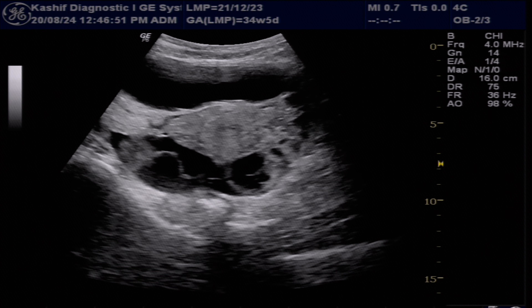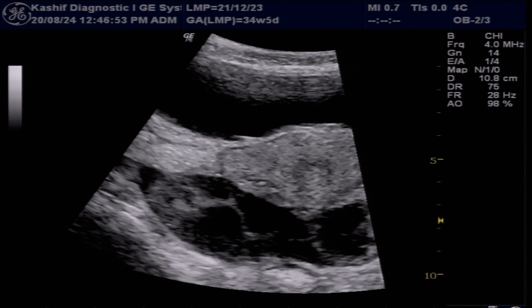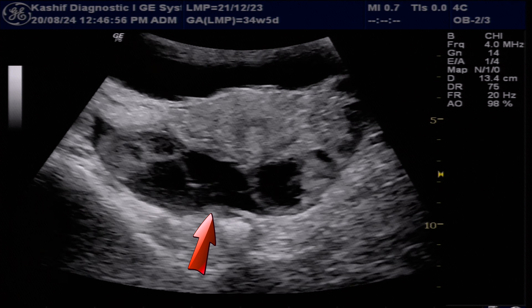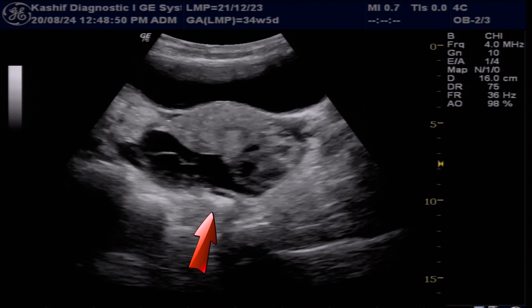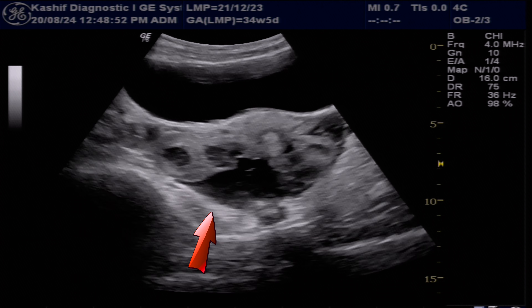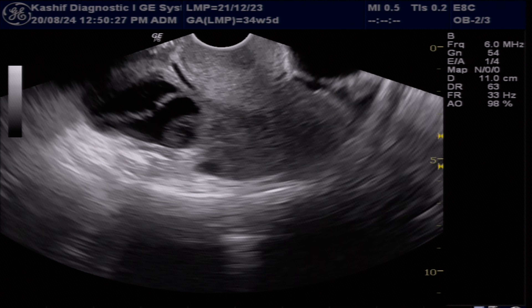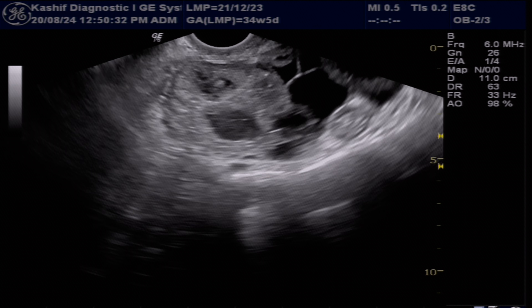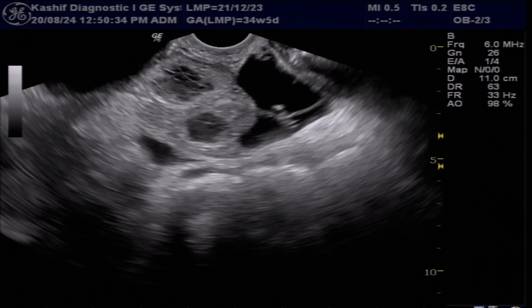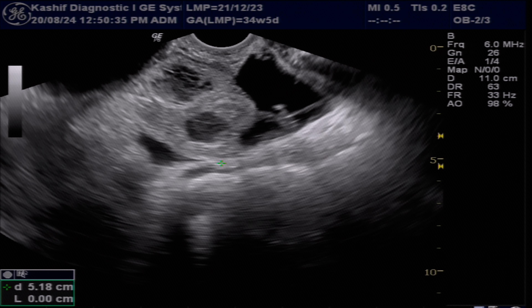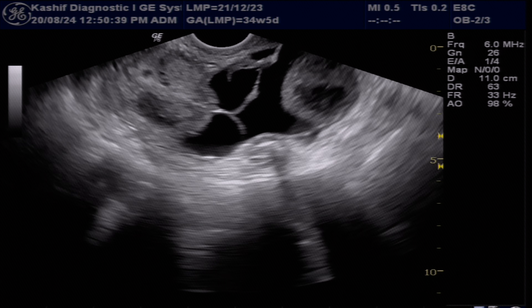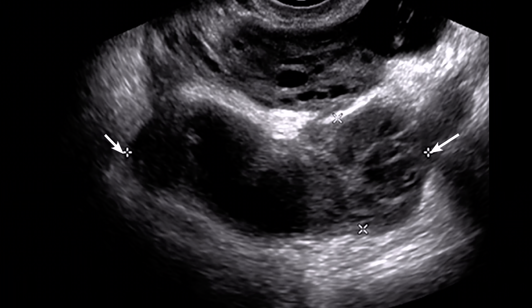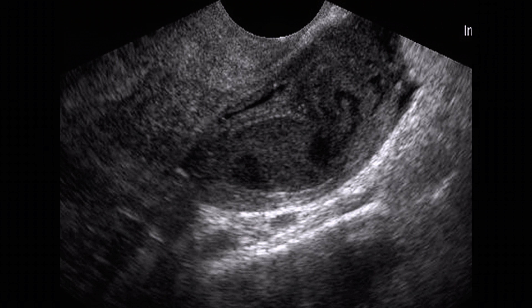Ultrasound can detect free fluid and pus in the pelvis and cul-de-sac. The cul-de-sac is a pouch-like space located between the uterus and rectum in females, serving as the lowest point in the pelvic cavity. Pelvic inflammatory disease (PID) is a condition characterized by the presence of thick fluid and pus along with septations. PID is caused by infections or tuberculosis and is a significant contributor to infertility in females.